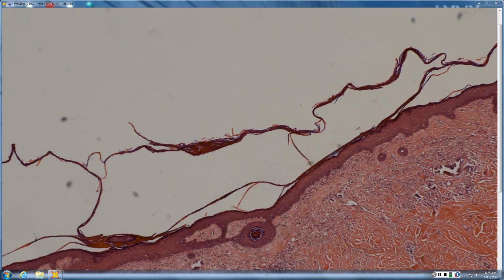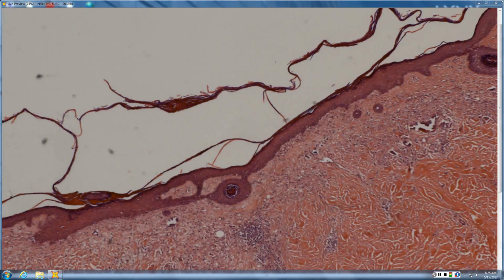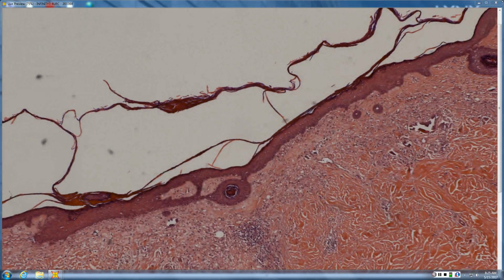So those tattoos are important to identify mainly because sometimes the scar is not very obvious. So they say they're doing a re-excision, and you don't see an obvious scar. Well, that's something you have to alert the clinician to. But if you see the aluminum chloride tattoo, you know it really was the biopsy site. So it can be helpful that way.